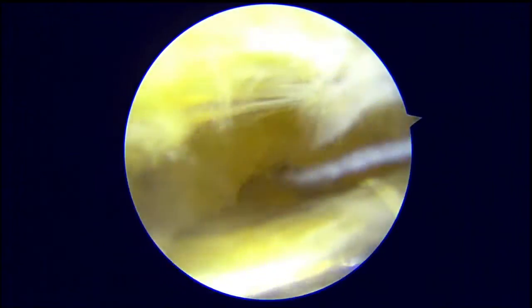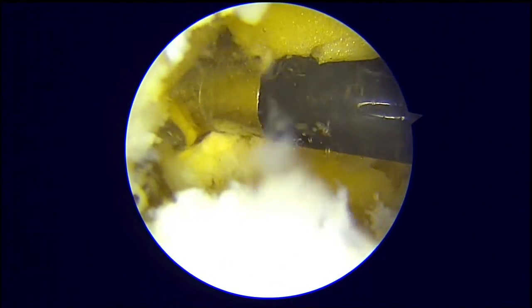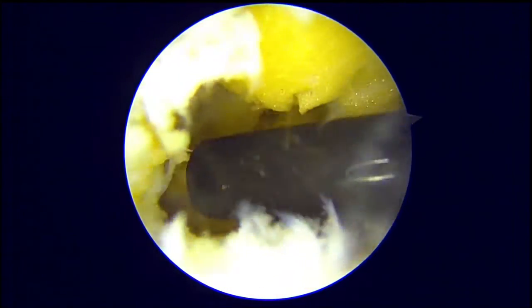Here a synovial shaver blade is being used to remove all this tissue. This is a very stiff joint, so we need to take our time to do this. But for those who love arthroscopy, it's really a fun procedure.